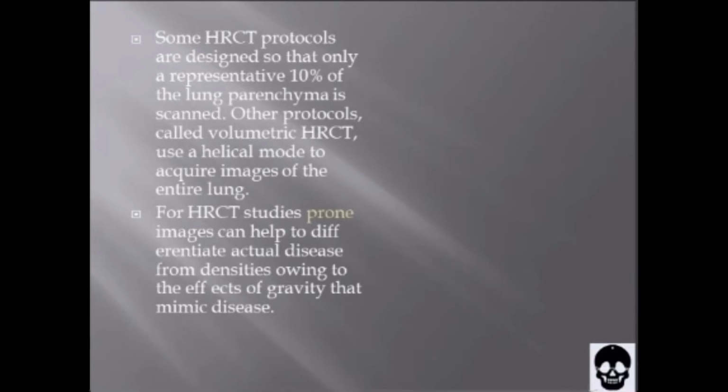Lung nodules that could be missed between slices in incremental protocols are not missed with volumetric high-resolution CT, and the central airways can be evaluated at the same time. In addition, they allow post-processing techniques such as maximum and minimum intensity projection reformation.